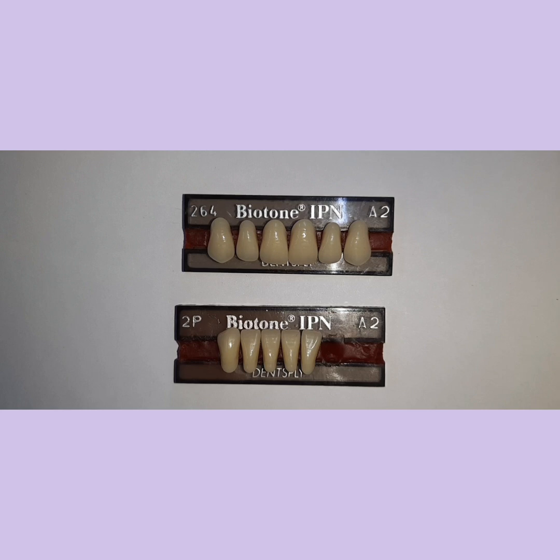First, the shade tab should be moistened. Secondly, you should use a white light or natural light if possible, and the light should not be focused for more than a few seconds. You should not focus directly for more than a few seconds, and then you should look at a blue background and then come back. Shade is also confirmed at a distance.